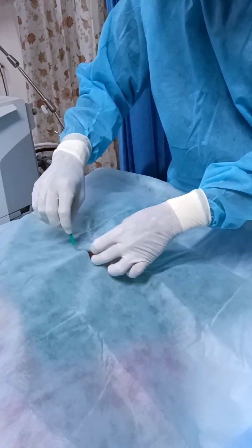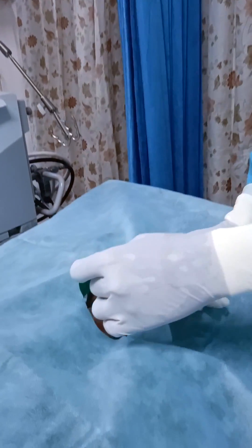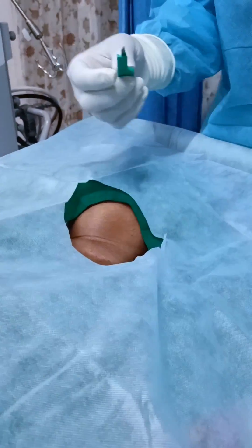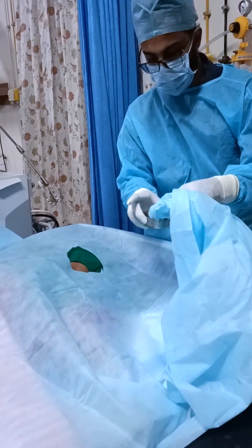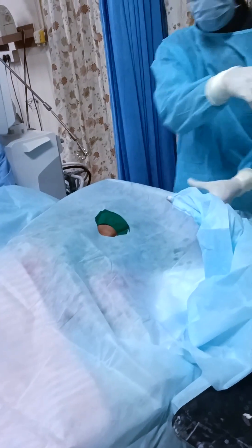Using the scalpel, make a small hole just over the top of the drape. It is highly recommended to use an ultrasound machine during the CVC insertion, which significantly lowers the risk of pneumothorax and arterial puncture.